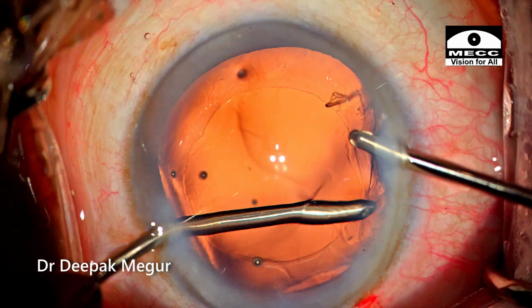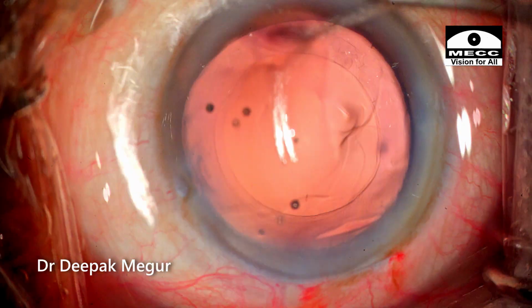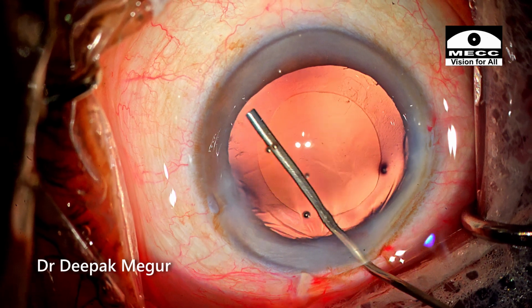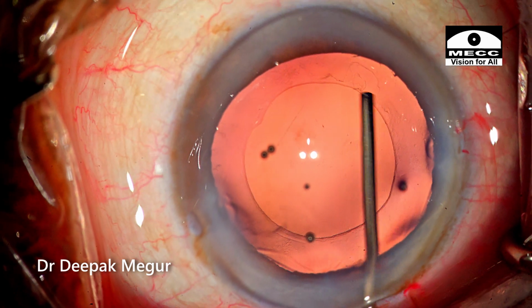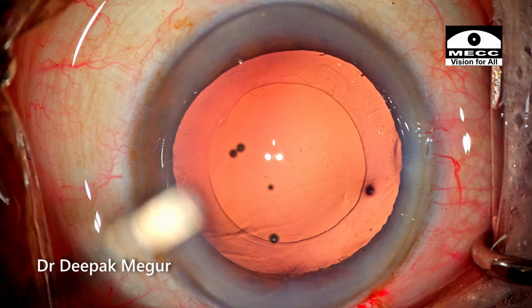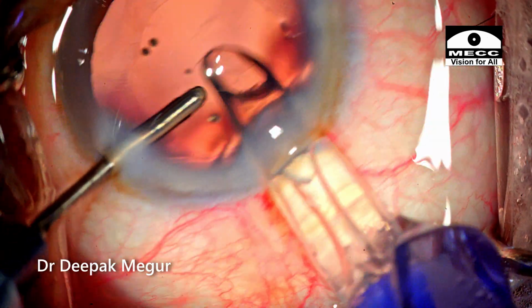The hands are switched, and similarly the remaining part of cortex is aspirated out. So the bag looks alright and quite clean now. I'm again going back and trying to flush the posterior capsule and remove some of the very small and minute lens fibers or particles which are sticking onto the posterior capsule. Intracameral antibiotic is injected into the bag once, and this is cefuroxime. I'm injecting a hydrophobic single piece lens using irrigation as the tool, and the bag is formed by the BSS itself.